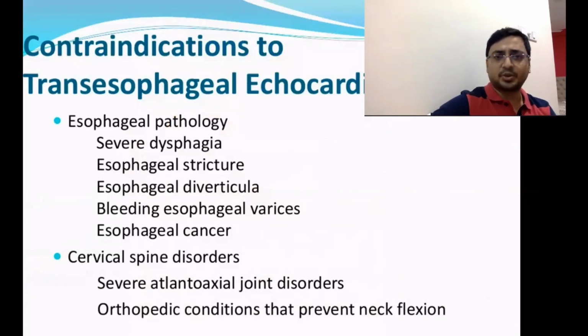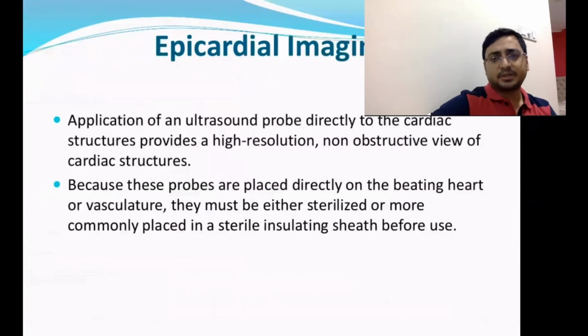However, we must know that there are some conditions where it cannot be used, like any esophageal pathology. In cases of dysphagia, stricture, diverticula, esophageal varices, and cancer, this is absolutely a no-no. Cervical spine disorders are also a relative contraindication for transesophageal echo.